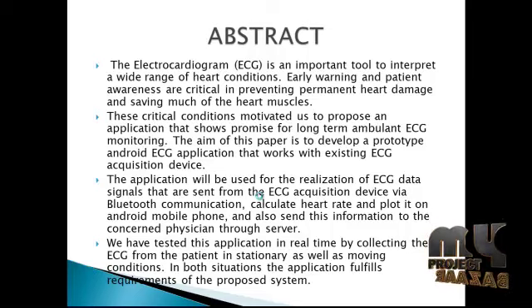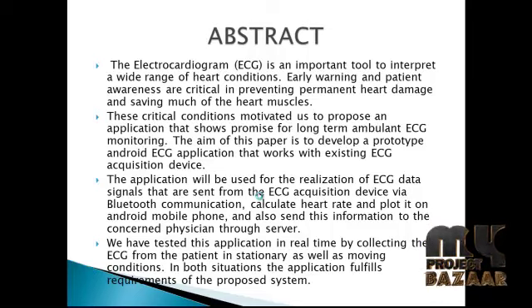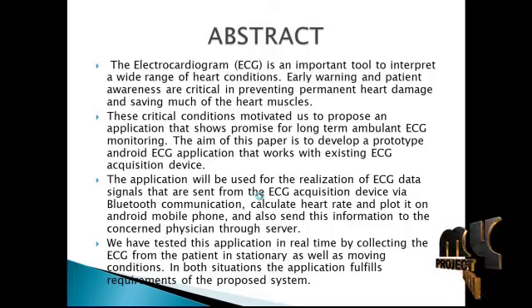The aim of this paper is to develop a prototype Android ECG application that works with the existing ECG acquisition device. The application will be useful for the visualization of the ECG data signals that are sent from the ECG acquisition device via Bluetooth communication, calculate heart rate and plot it on an Android mobile phone, and also send this information to the concerned physician through a server.